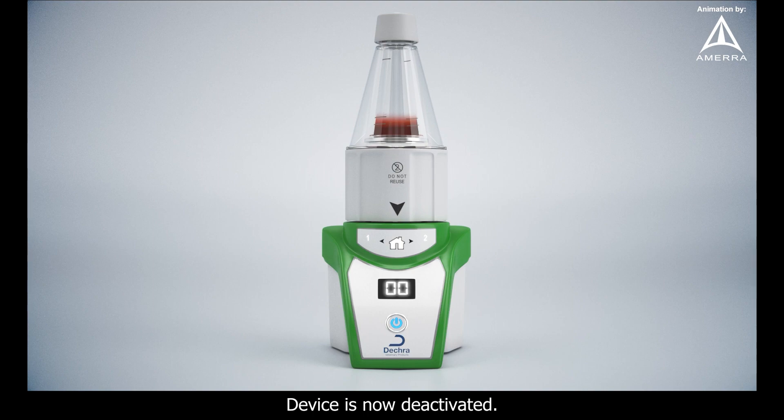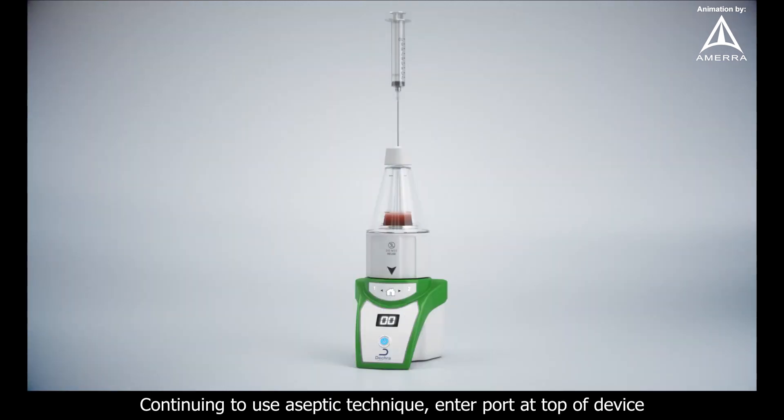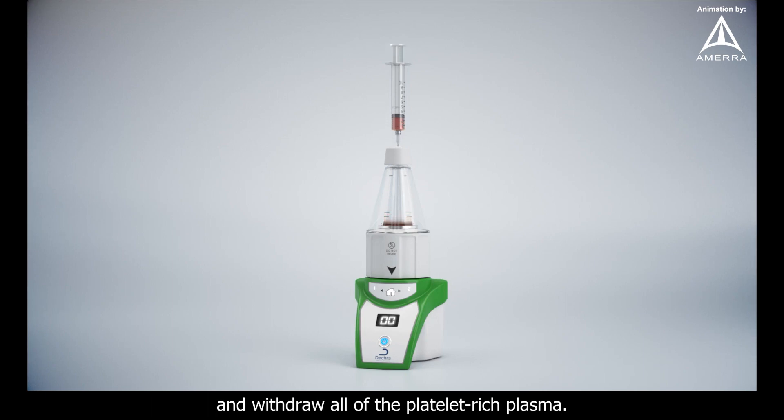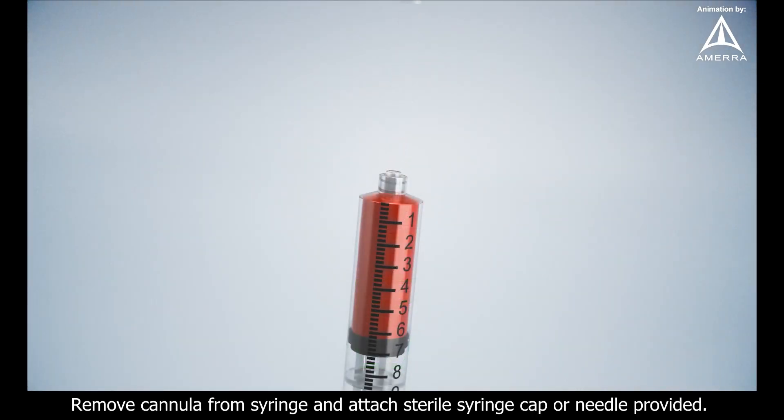Device is now deactivated. Using the provided 10 ml syringe, attach the second sterile cannula provided. Continuing to use aseptic technique, enter port at top of device and withdraw all the platelet-rich plasma. Remove cannula from syringe and attach sterile syringe cap or needle provided.